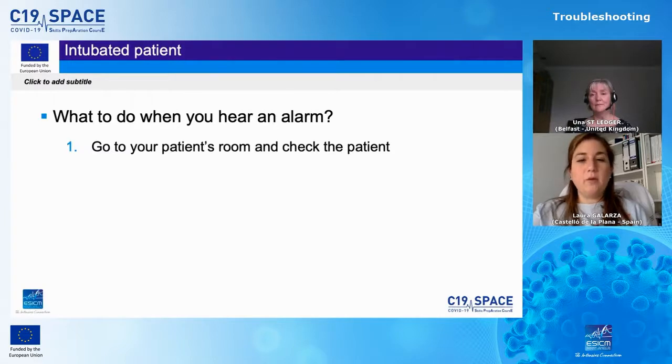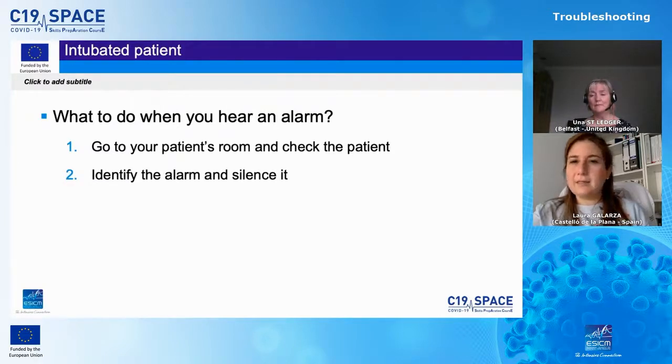And after checking on our patient, we should identify the alarm and silence it. And why should we silence it? That's because a constant beeping will distract us from thinking, which is our next step. We should always think before we act.